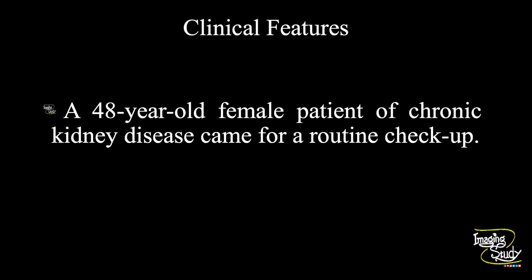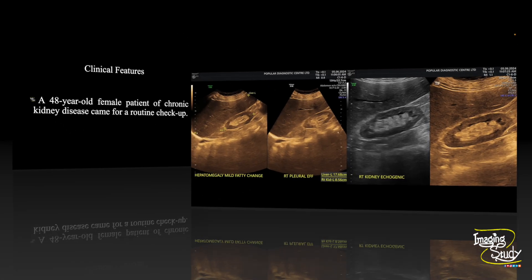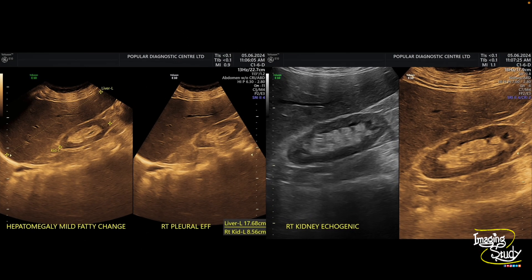A 48-year-old female patient with chronic kidney disease came for a routine check-up. Let's see what we have got on ultrasound. Here I'm going to show you the picture of the liver and right kidney. There was mild hepatomegaly with fatty change, which is not a concern in this case right now.